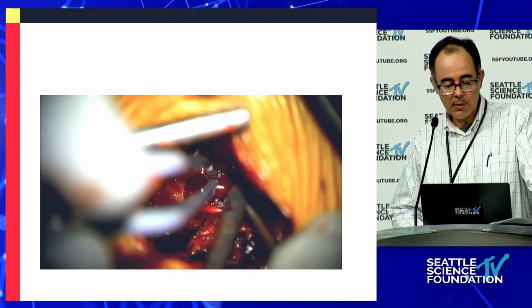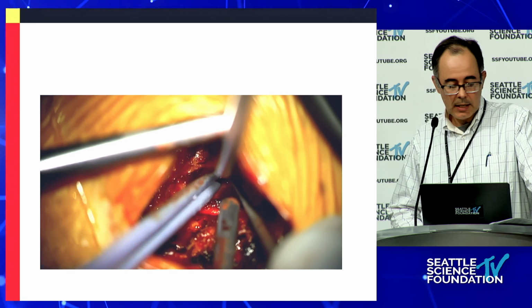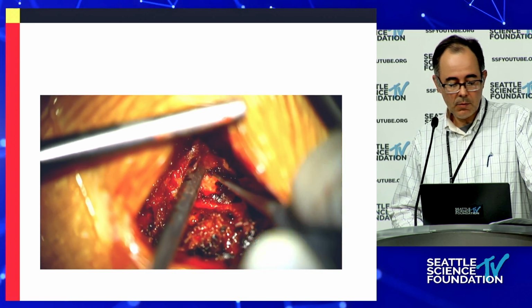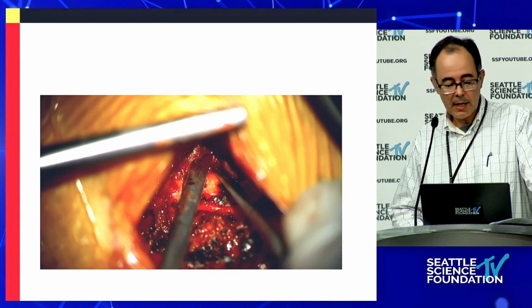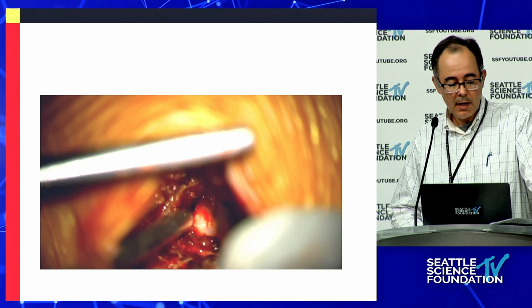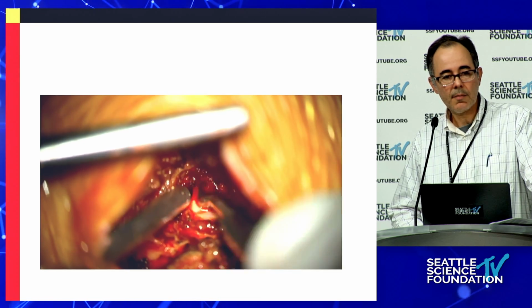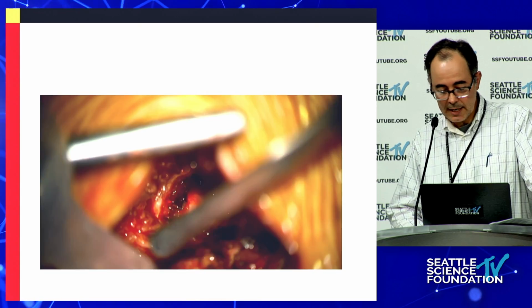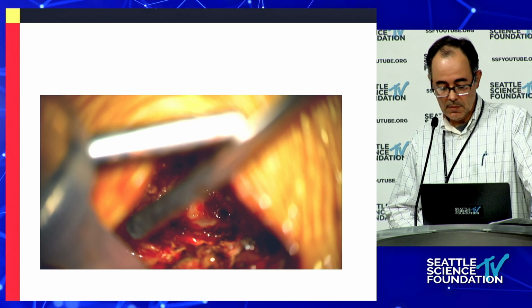You can appreciate the nerve root is basically at 12 o'clock right there. And I'm breaking through the epidural venous plexus with this nerve hook and just coagulating as needed. And ultimately, the goal is to be able to put a Woodson into the foramen to verify satisfactory patency of that foramen. And that's basically a foraminotomy. It can be a very quick and efficient procedure for a patient with unilateral radiculopathy, but with enough degenerative changes that you can't do an arthroplasty.